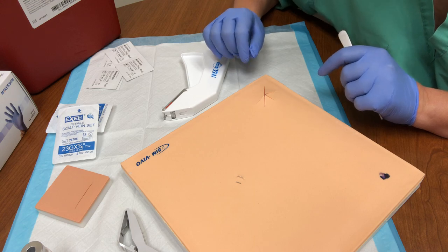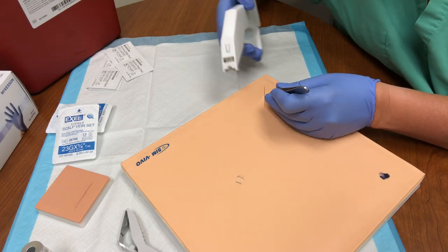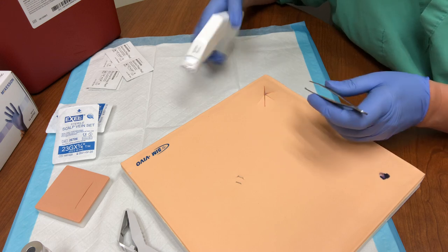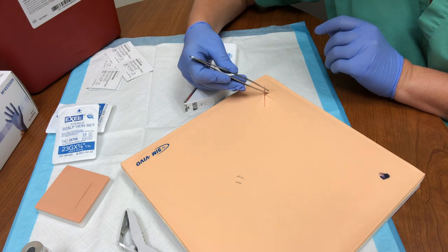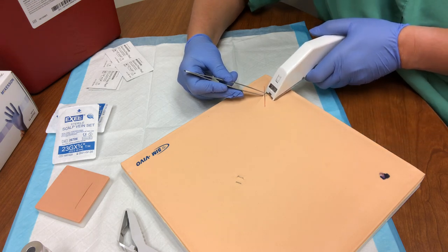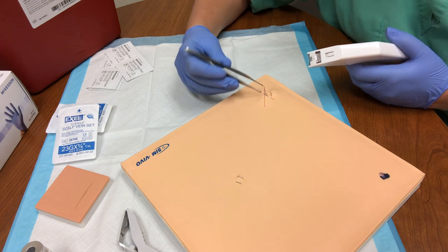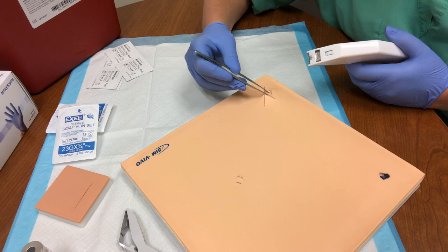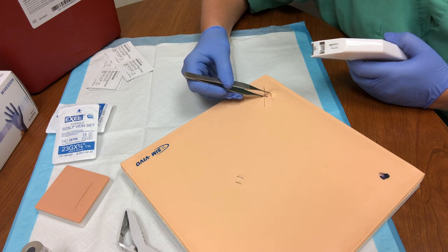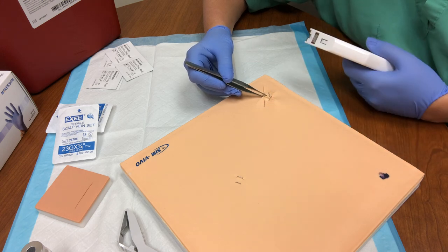Often times what I will do is start at one of the points and try to re-approximate that point to one side. It does mean pulling the end of that point and then stapling that area to the adjacent structure. You'll notice even here there's some natural eversion going on, and I'm also pulling on this area right next to it — that is truly what's going to happen in real life. So you kind of want to walk yourself around the wound and try to re-approximate part of that wound to another area.